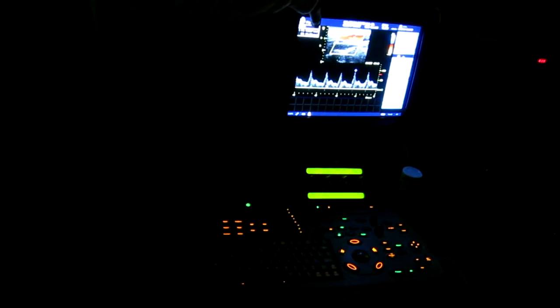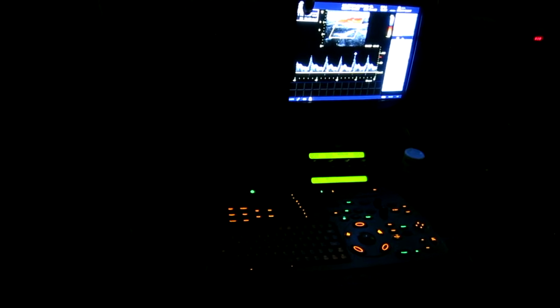So that's almost a meter per second. Ninety-seven, ninety-three centimeters per second at systole, and twenty-six at diastole. But it's the lowest, okay? We're going to save that. Back to real time.